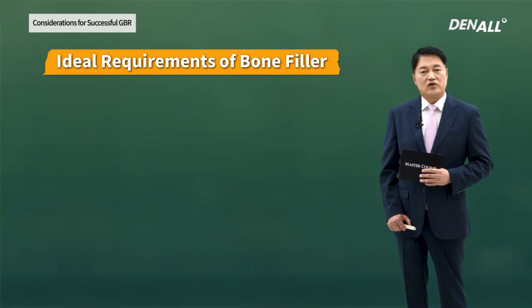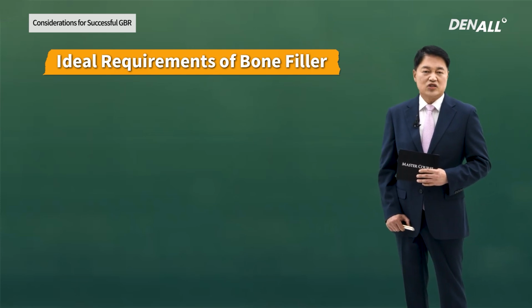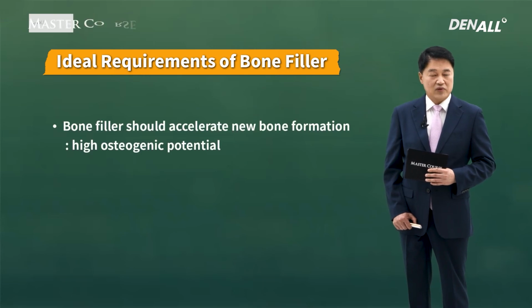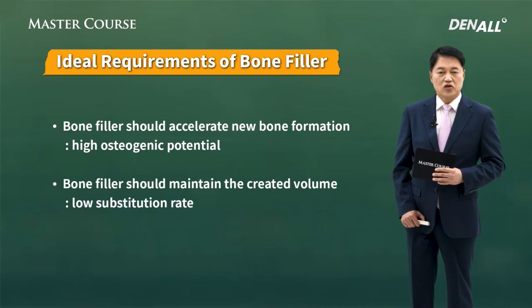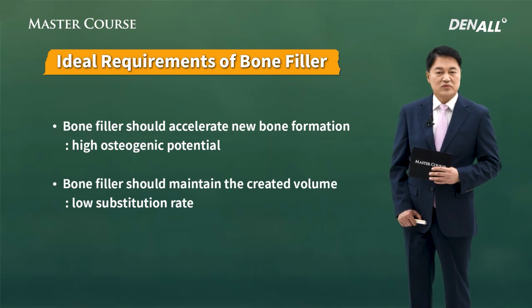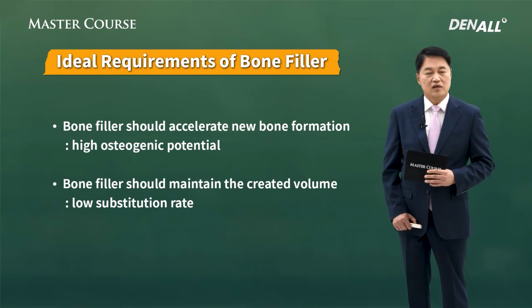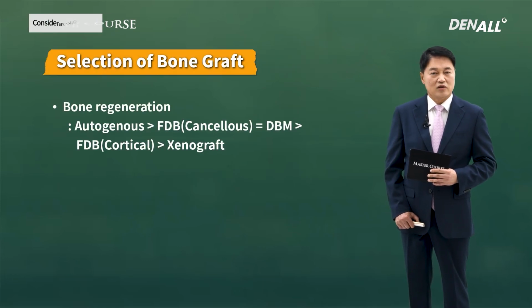Let's look at the bone fillers. There are requirements for that. First is high osteogenic potential. It needs to accelerate new bone formation. Another point is it should maintain the created volume. It shouldn't be resorbed too quickly, and it should be maintained for the long term. Ironically, the two have contrasting concepts.